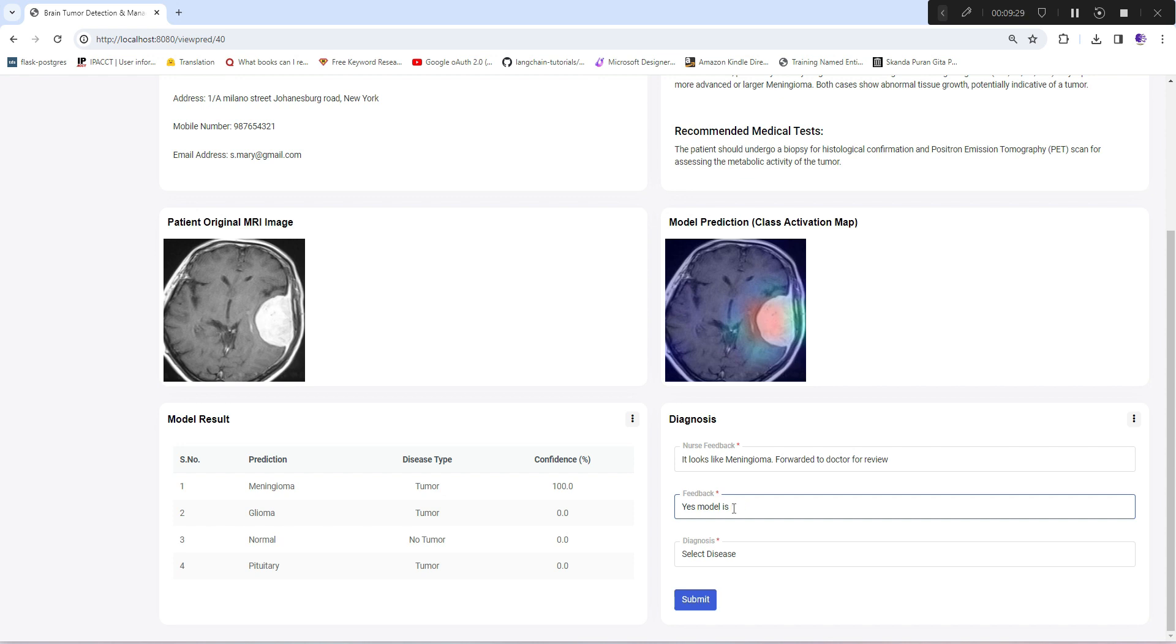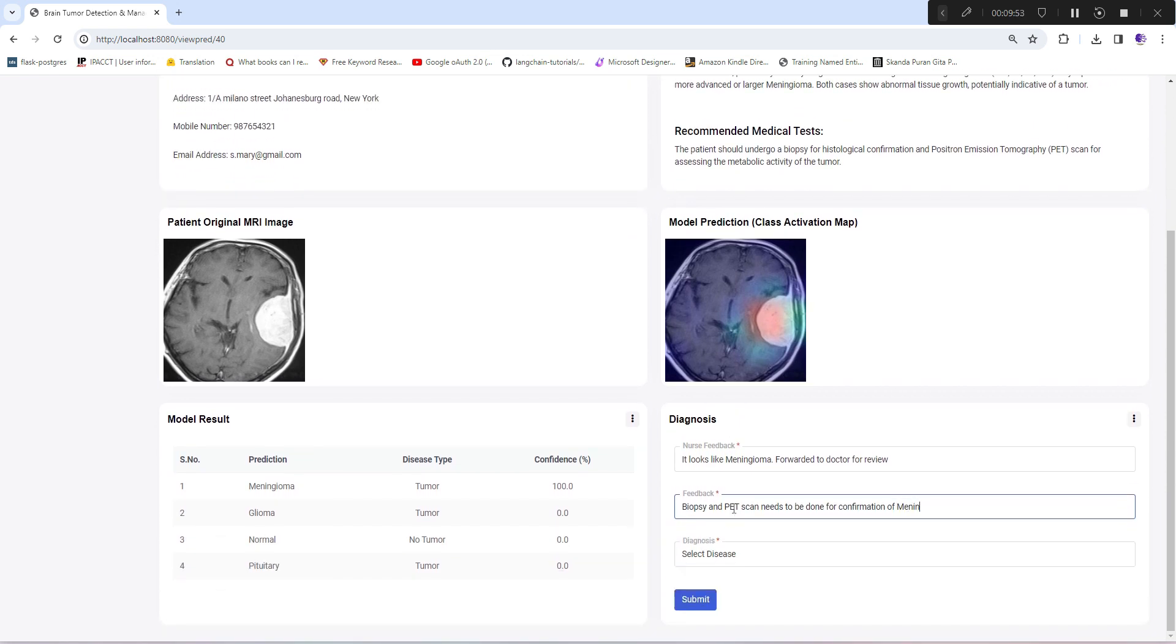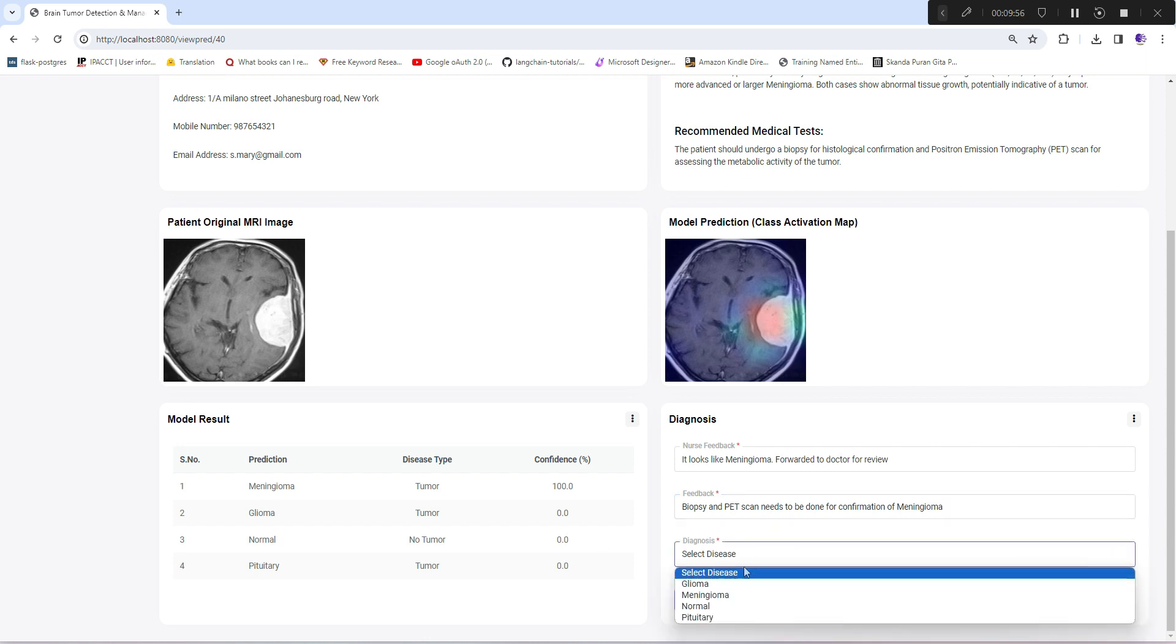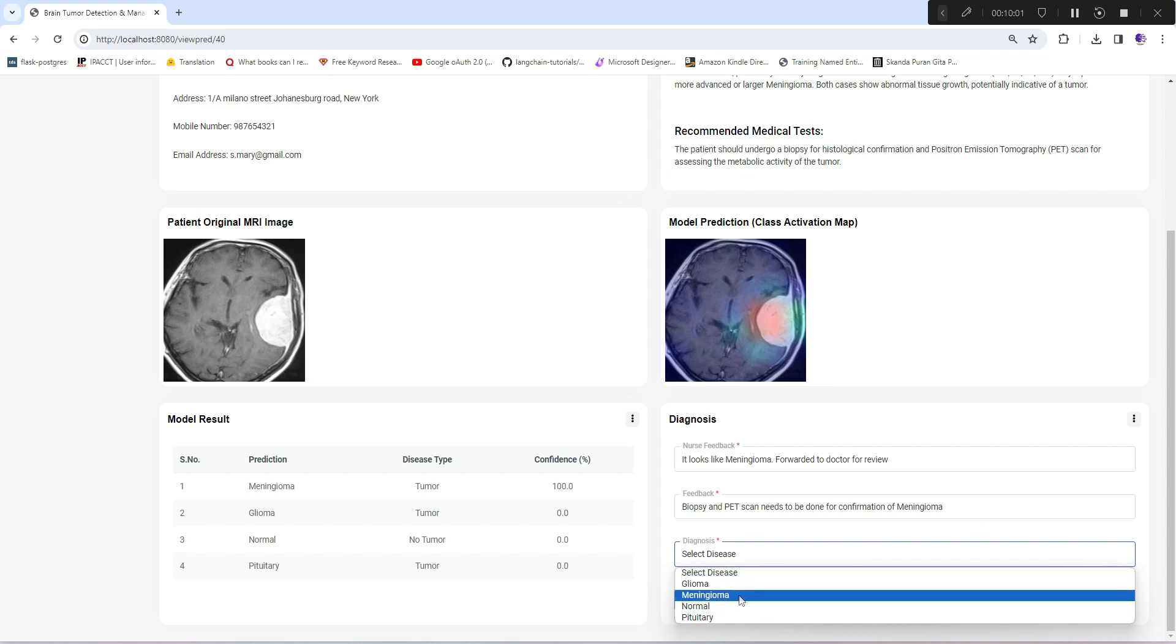I'll quickly add: "Biopsy and PET scan needs to be done for confirmation." For disease type, I'll select meningioma. Here he can select or not select any disease because it's still not confirmed, but I'm selecting it to close this case.